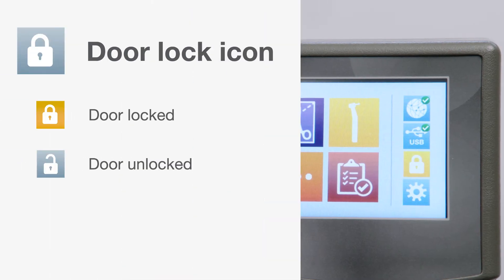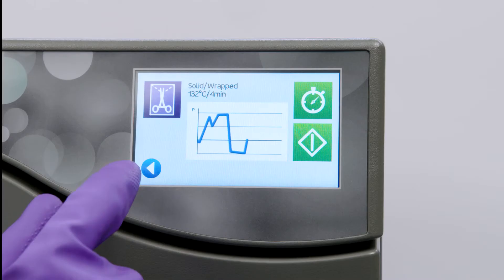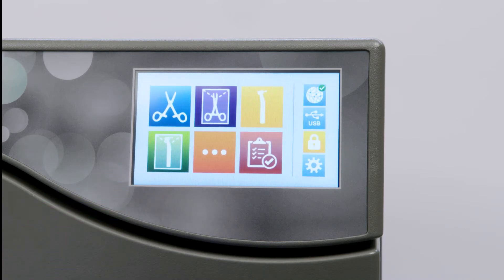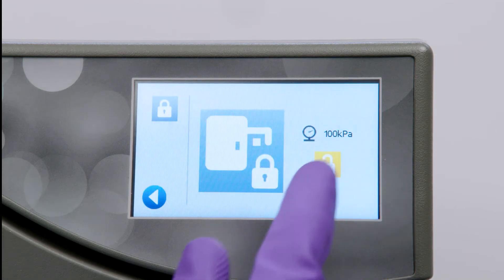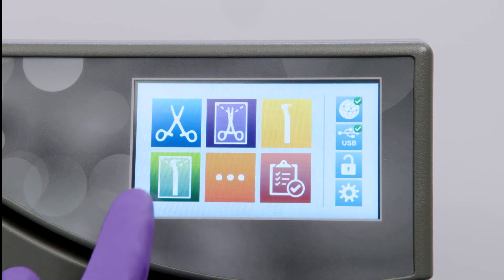The lock icon will indicate if your door is locked or unlocked. The StatClave will lock the chamber door when you select a cycle. If you need to unlock the door before starting the cycle, press the back arrow to return to the main menu. Press the lock icon and press the yellow unlock button. You will hear the door lock release and you can then hit the back arrow and open the door.